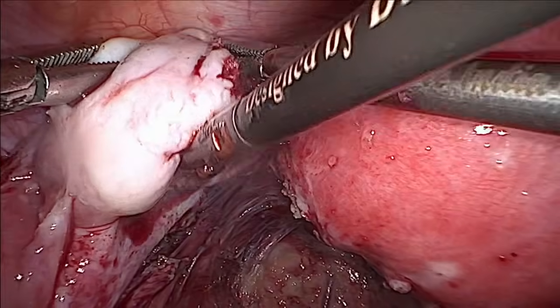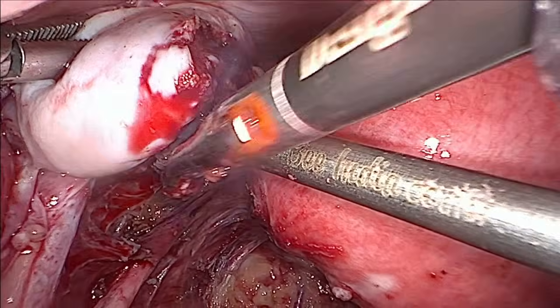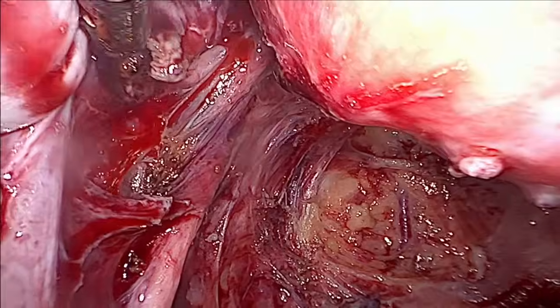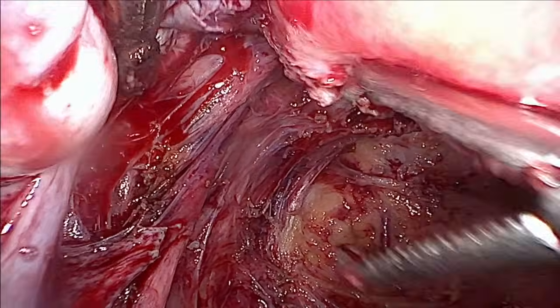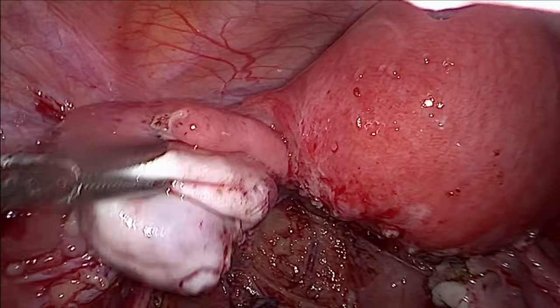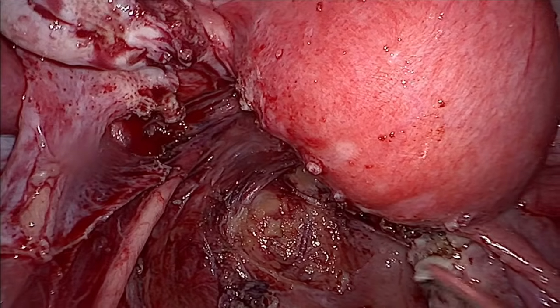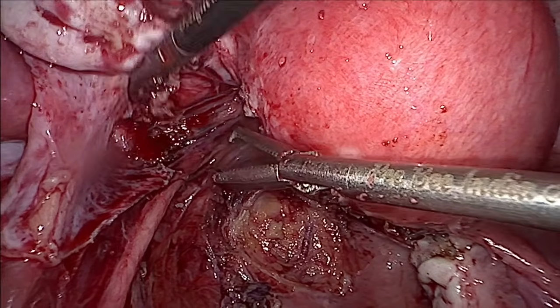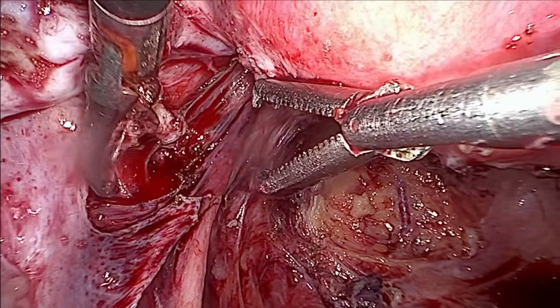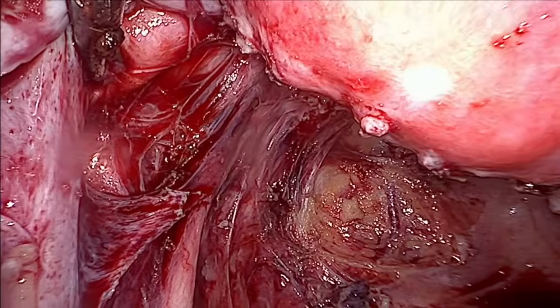Okay, you can see here. Okay, you can see there is some oozing from somewhere. I think this is the spot.